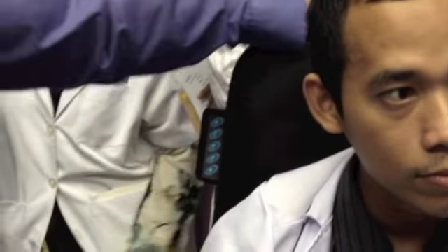This. Boleh? Okay? So vibrate. That's Rinne. Interpretation of Rinne, read in the books. You will have a class on it. Okay, now Weber. The one we use is 256, is it?